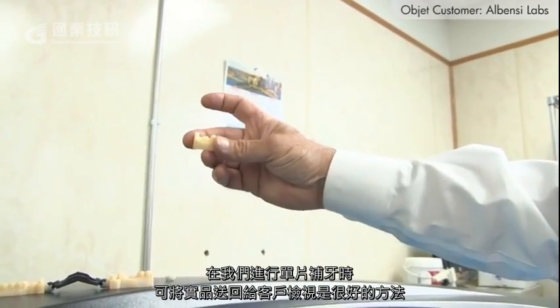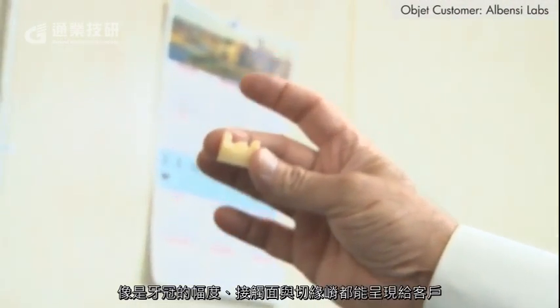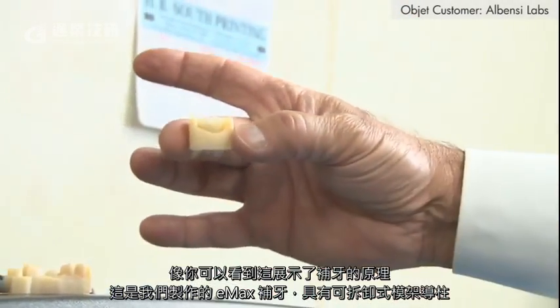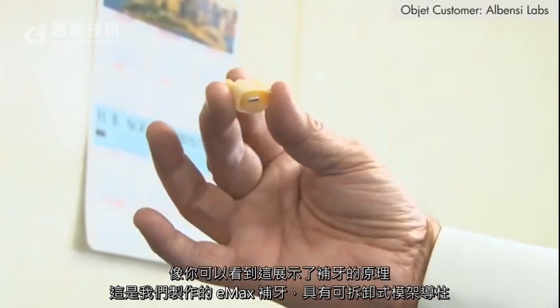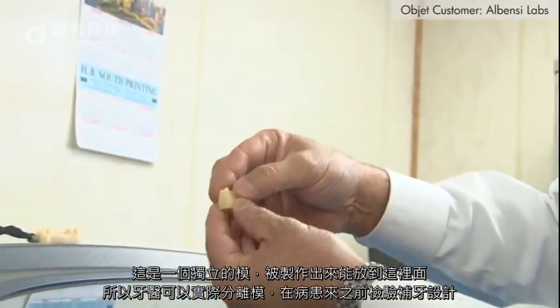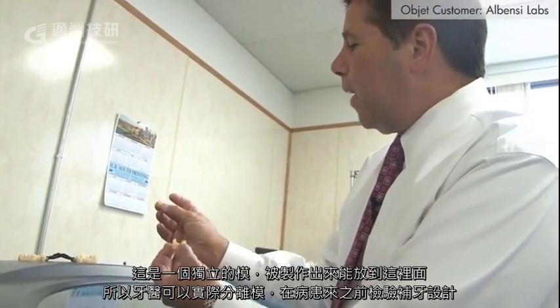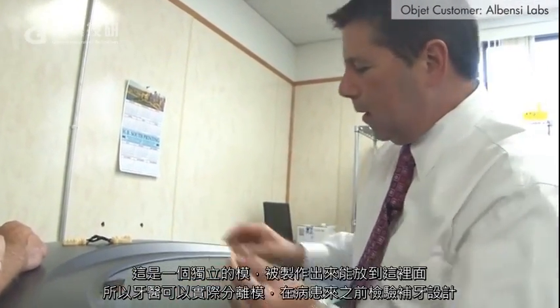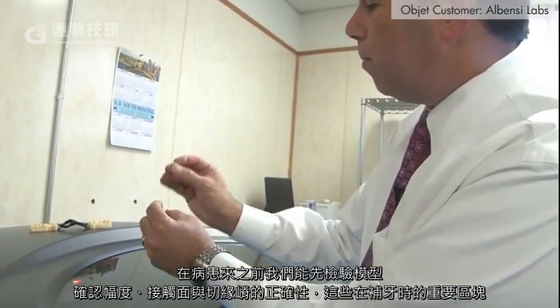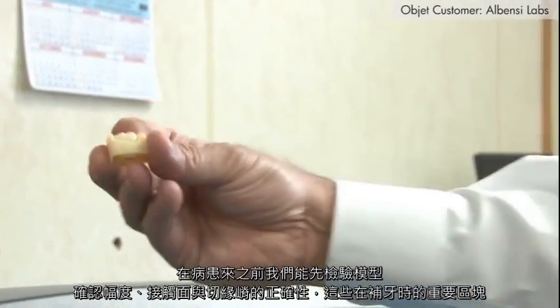When we're doing monolithic restorations, we like the idea that we can send something back to verify both the margin and the contacts and the marginal ridge of the crowns that we're sending back to the client. This is an Emax restoration we produced, and we do have a removable die. This is an individual die that was created to fit inside here, so the dentist can actually remove the die and examine his restoration prior to the patient coming into the office. He can check the marginal integrity of the case, as well as the contacts, two major areas that doctors have in fitting restorations.